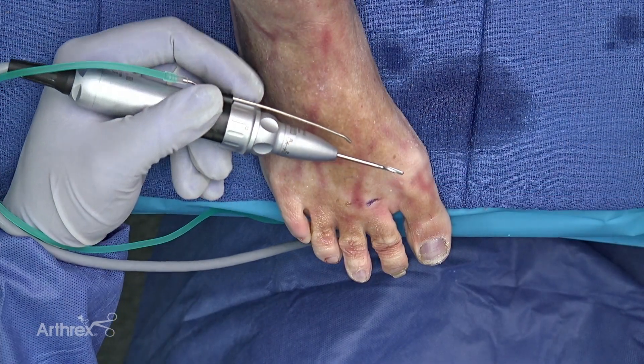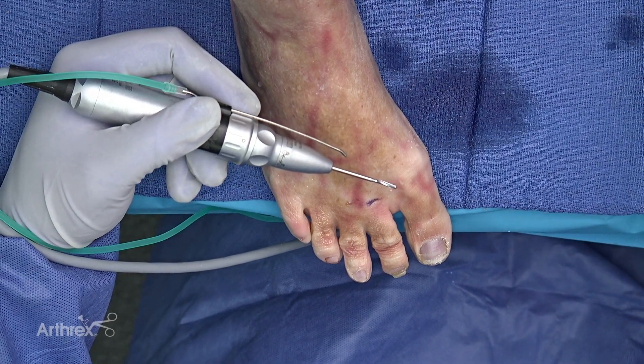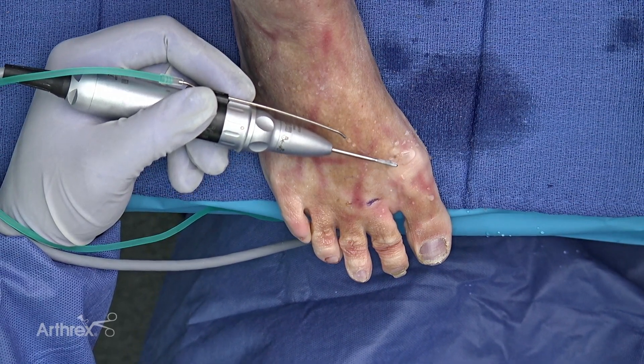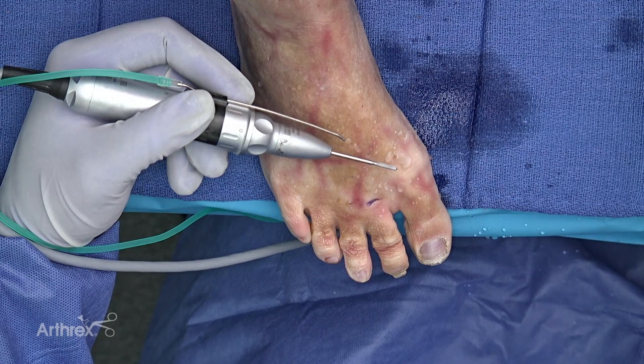For the purposes of this demonstration we didn't use the irrigator, but every time I do this surgery in a live fashion I will use the irrigator. You can see the irrigator delivers a constant flow of saline to the field to decrease temperature and decrease the risk of thermonecrosis.